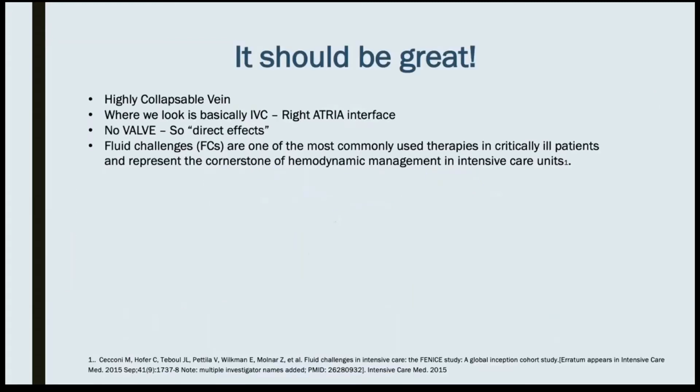So why do we ultrasound the IVC? Because it sounds great, right? It sounds like we've got a big vessel, it's directly connected to the right heart, it is in the right atrium. It should show fluid status, as we were taught what fluid status would be. And then it's got no valves, like the superior vena cava might have some valves, and the internal jugular has valves.